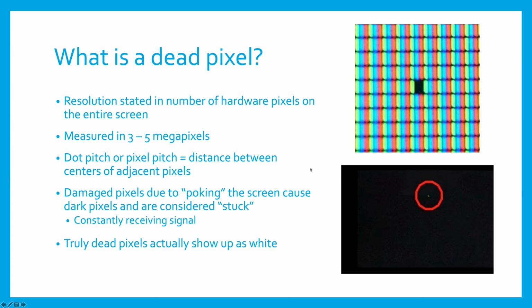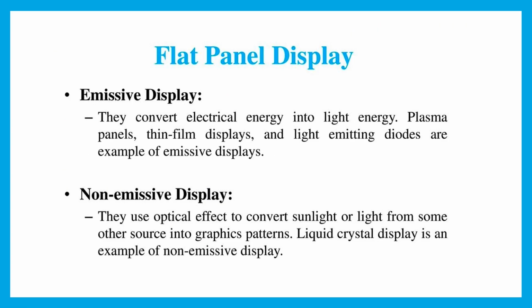And then again, we talk a little bit about how resolution is measured, and it's measured in megapixels, which should sound familiar. So in flat panel display, the lighting that you receive is either emissive display or non-emissive display.